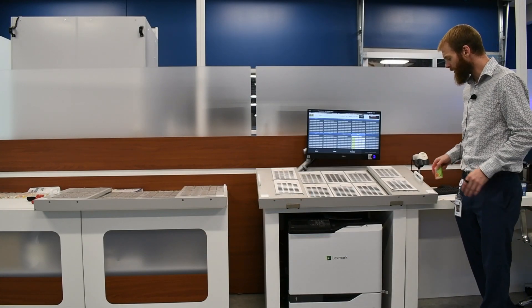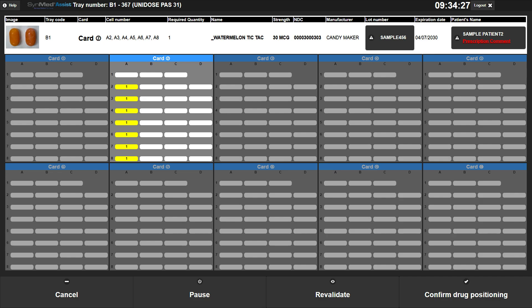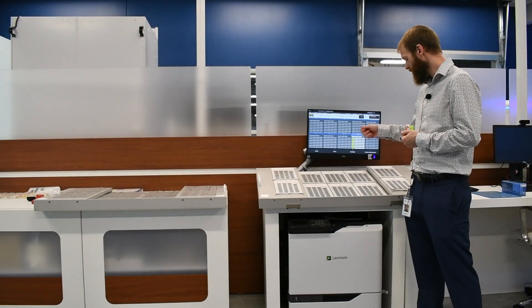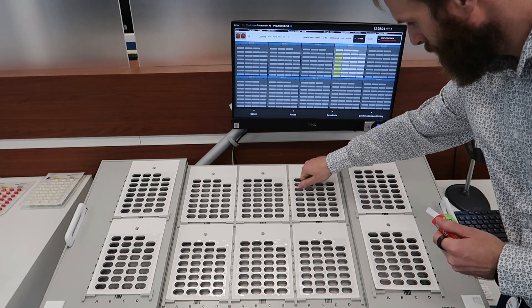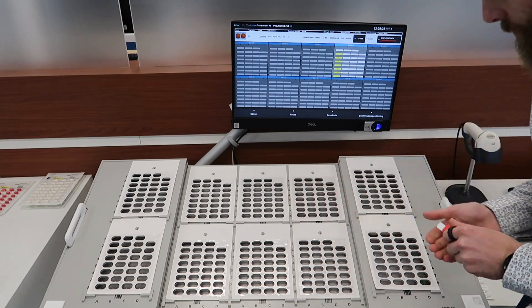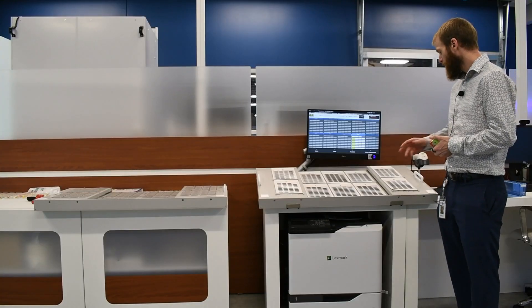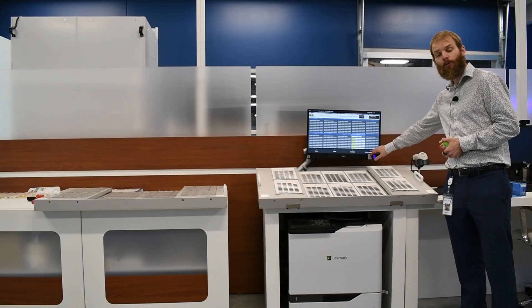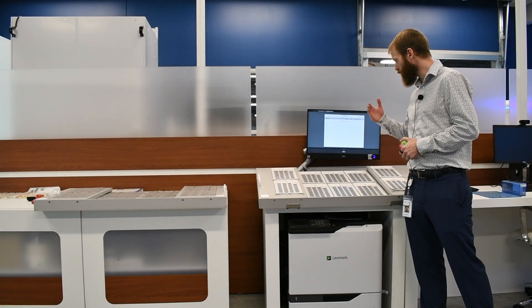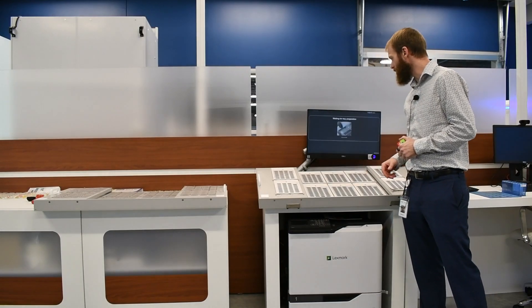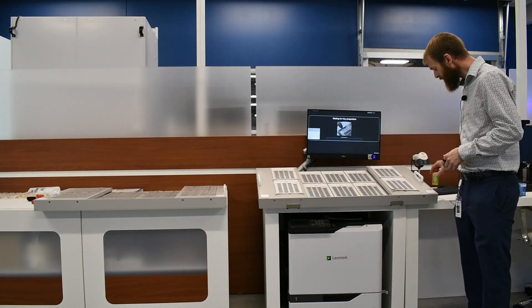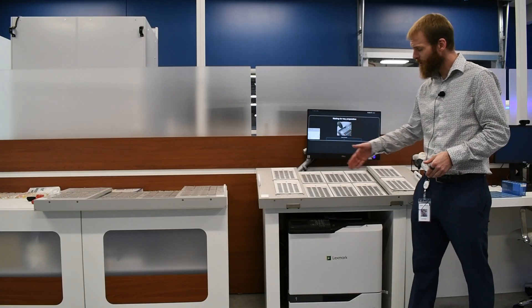The system is going to ask your technician to scan one of those stock bottles. When they scan that stock bottle, it is going to light up on screen the cards and the locations in those cards that need that particular drug. Your technician will then go through and fill those blister cards, confirming that they dropped the drugs in the appropriate location. If it's not the entire tray, they will move on to the next drug in the list until they fill the entire tray.